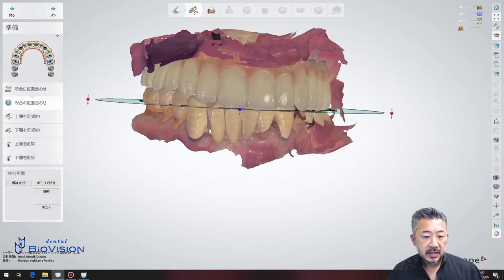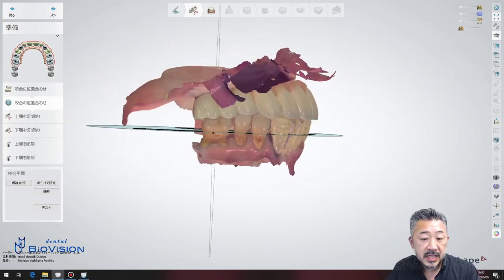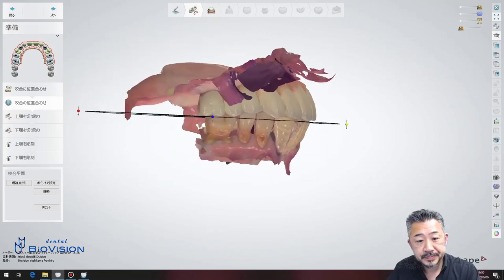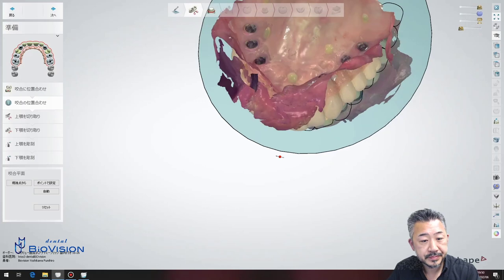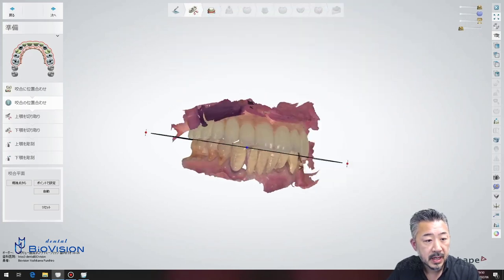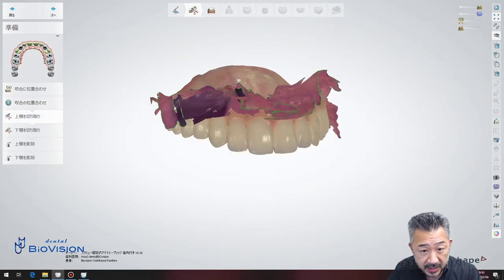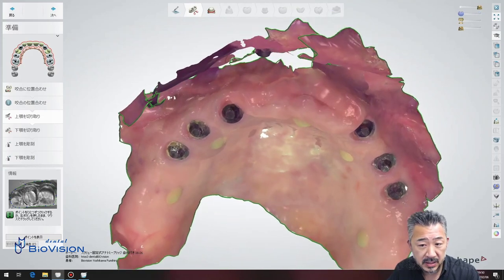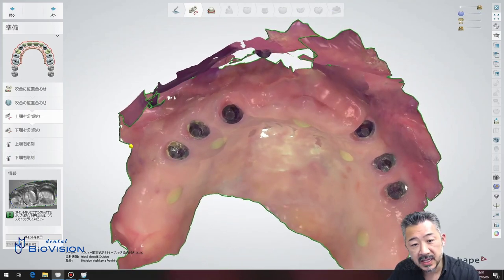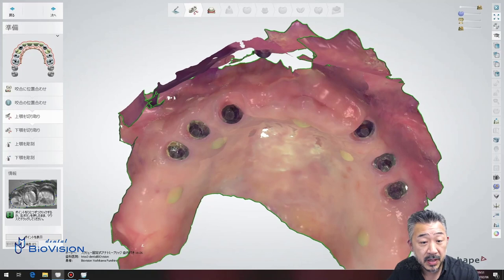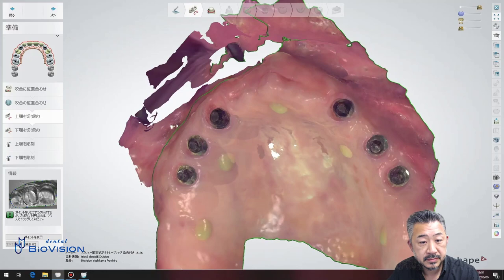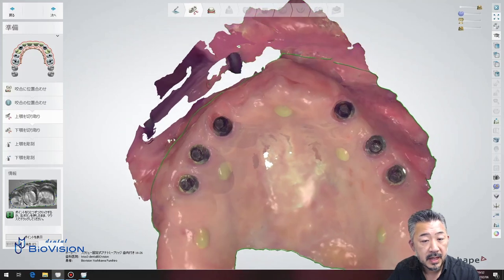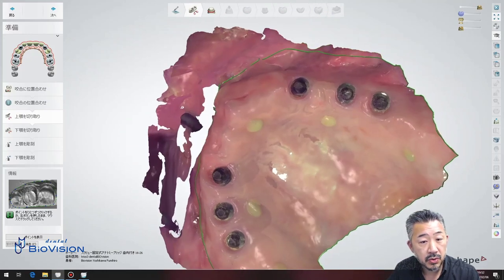Start up the order form and align the occlusal position. Next, in the cut item, trim the unnecessary parts for the upper and lower jaws. For the upper jaw draw the line like this, and also for the lower jaw.